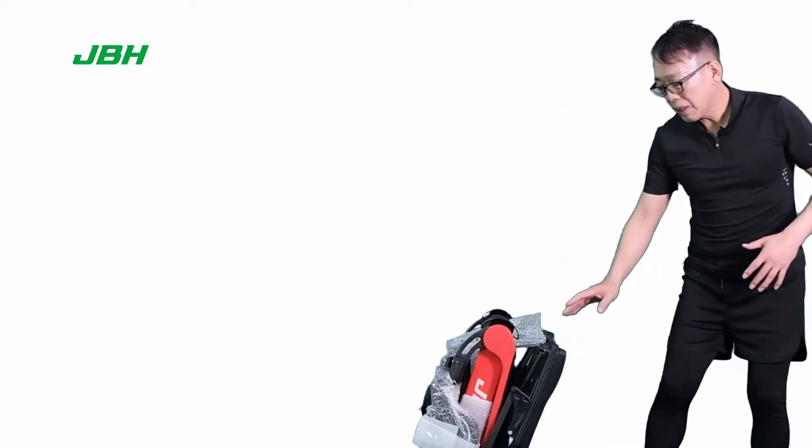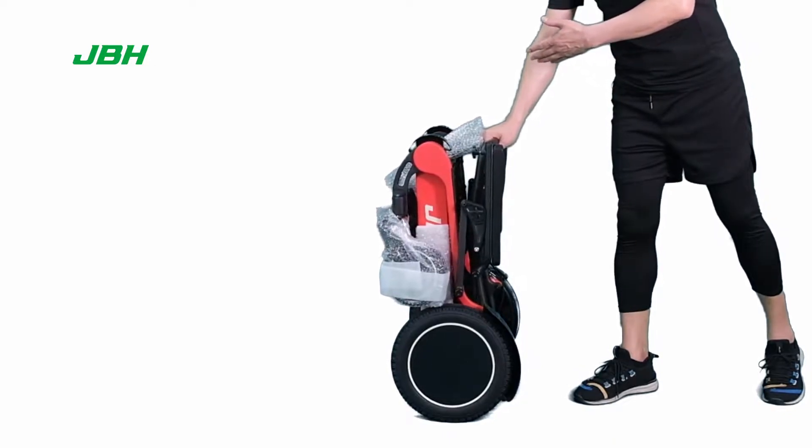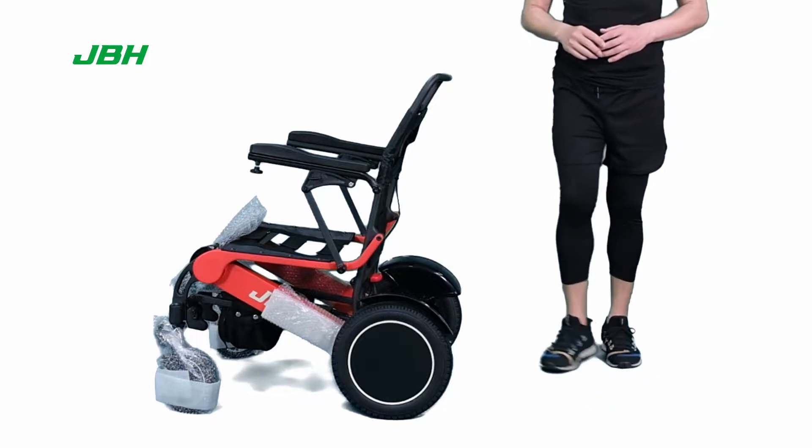Next step, we just need to open the wheelchair by holding one hand on top of the seat back, tilting the wheelchair towards the front a little bit — you can open the wheelchair in just one second.